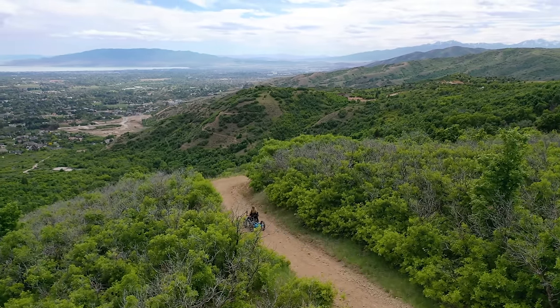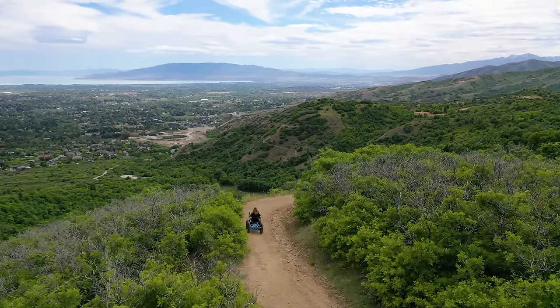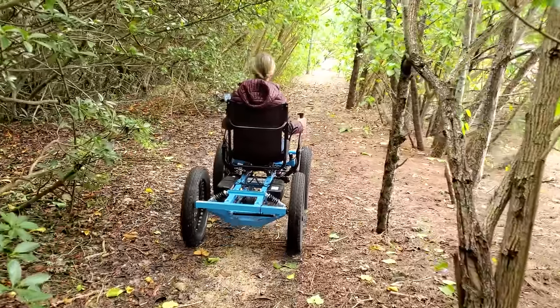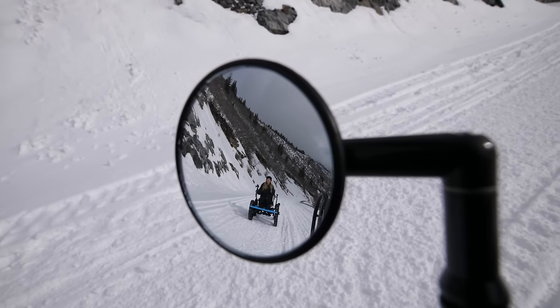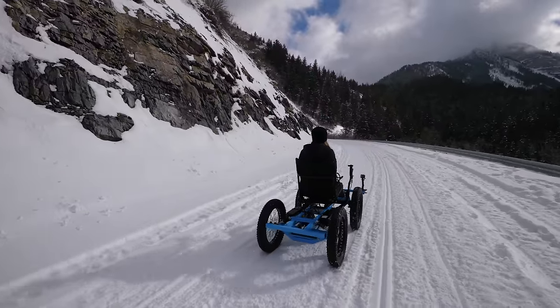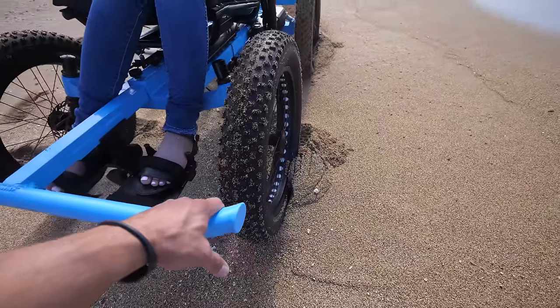Personally, I love my light blue rig. We've put over a thousand miles on it and it's taken me places I never in a million years thought I could go — like on a hike to a waterfall in Hawaii or up the canyon on packed snow, which are all places I wouldn't be able to go in my normal wheelchair. We've taken the rig on paved roads, dirt roads, gravel roads, and it handles pretty well, but it does struggle a bit with loose sand and loose snow, kind of just like any bike would.